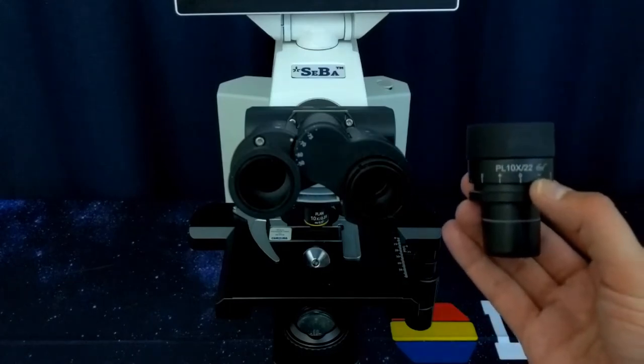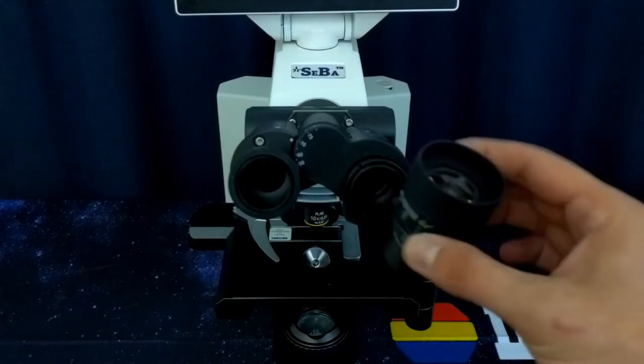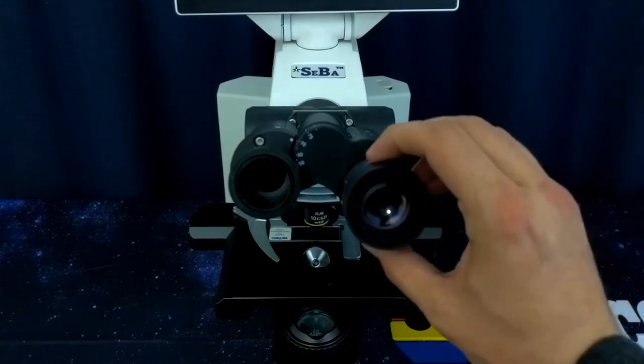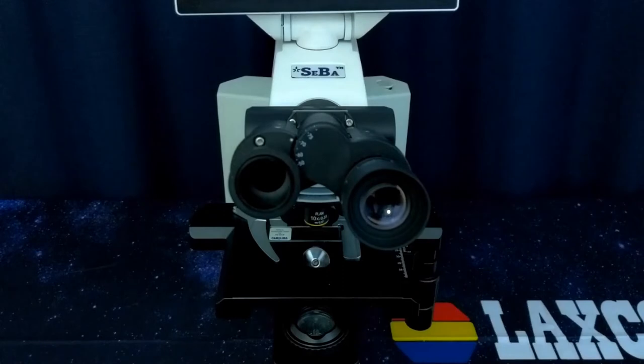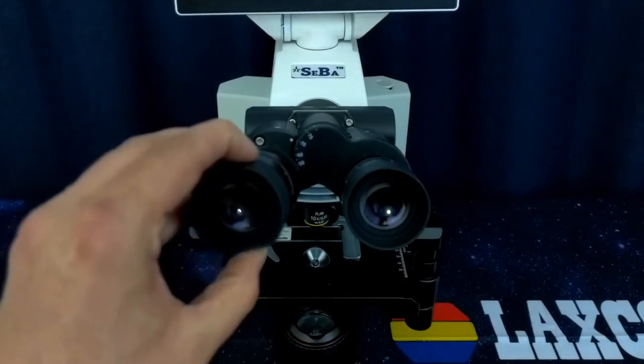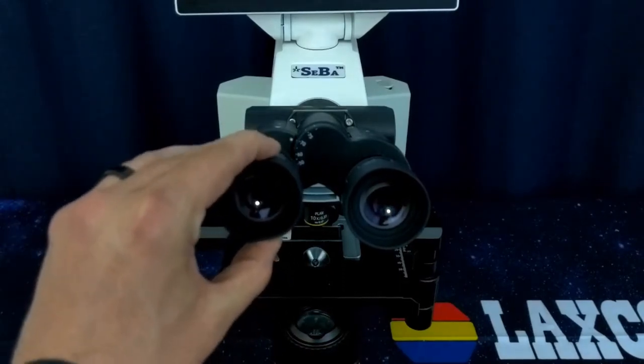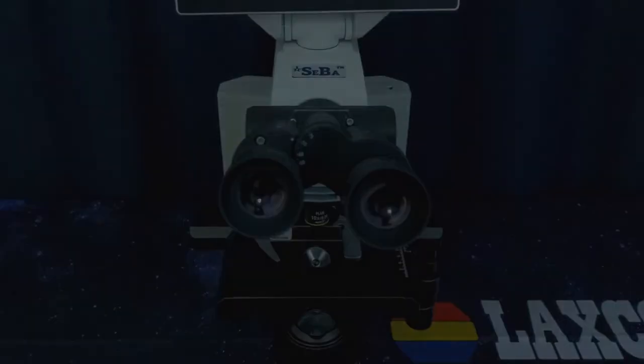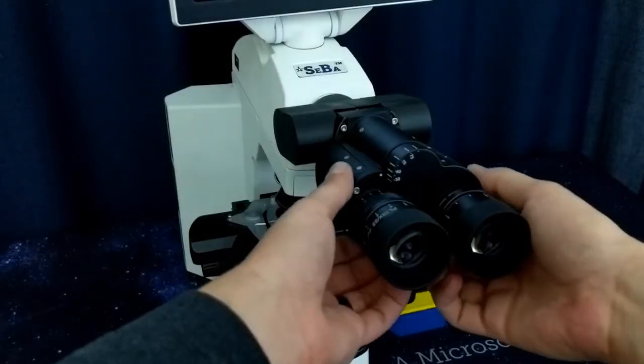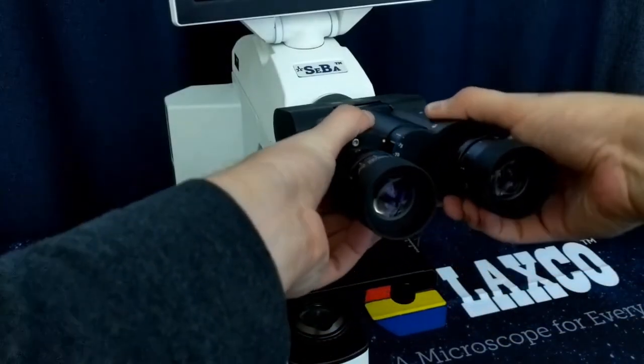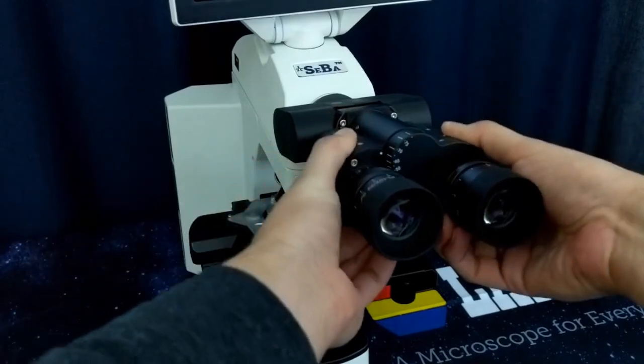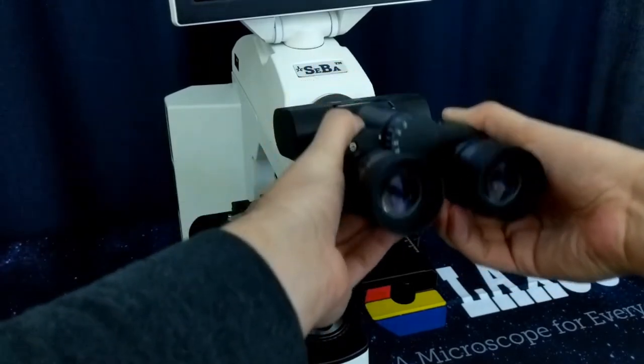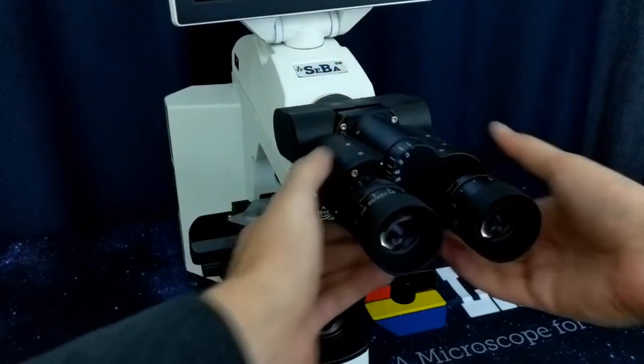Remove the eyepieces from their packaging and insert the eyepieces into the eye tubes. Repeat for both sides. Set the interpupillary distance so you can see clearly through both eyepieces, and then set the height to your comfort.